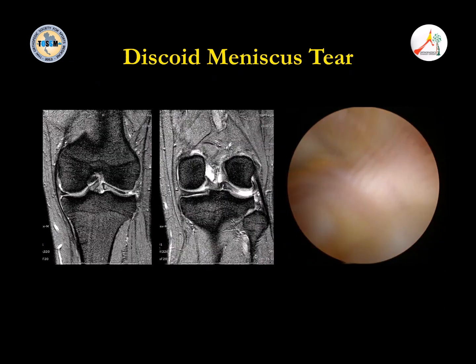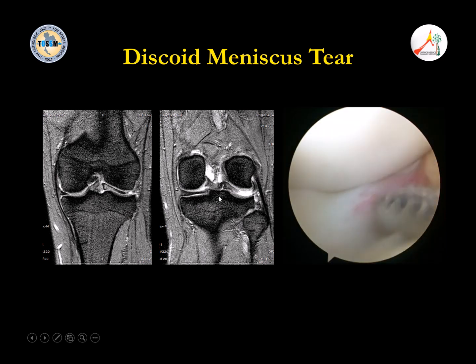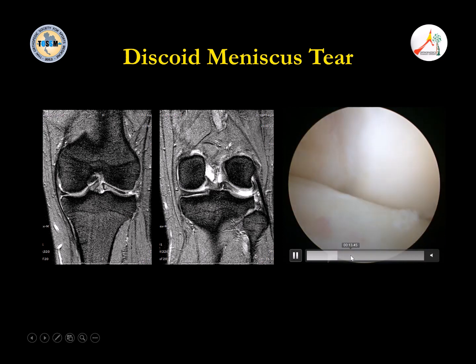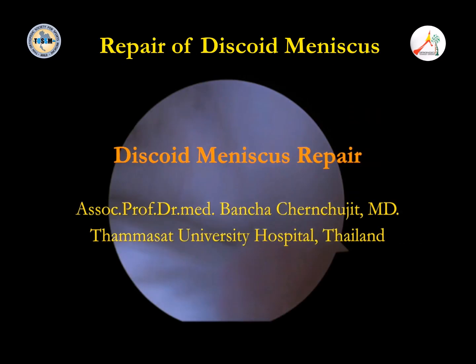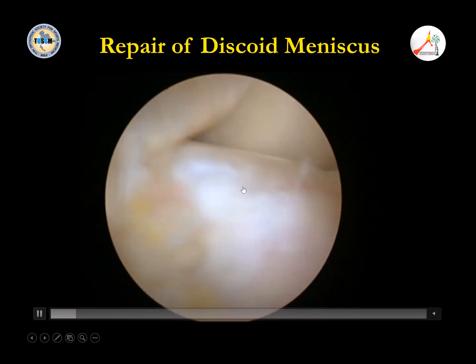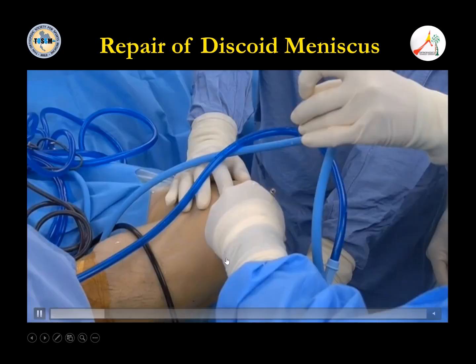So last pictures. This is a bucket handle tear of a discoid meniscus. For the discoid, it's quite difficult because the meniscus is deformed. You need inside out first to reduce this discoid. You see this discoid is quite big and also spread. We cannot reduce it back because of chronicity.